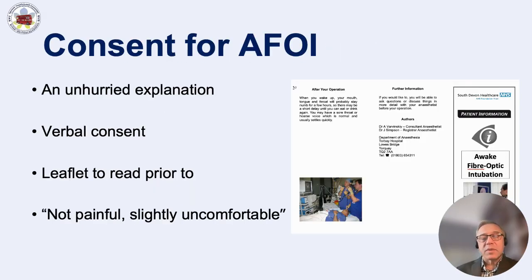We need to consent this patient in an unhurried way, with an unhurried explanation. It is a verbal consent in my country, and they don't have to sign anything. We have developed this leaflet, which is on your screen, which the patient can read beforehand if there is time. And usually I say this procedure isn't painful, it's slightly uncomfortable, and I will make sure that I give you enough sedation, enough analgesia, and enough local anesthesia to make it more comfortable.